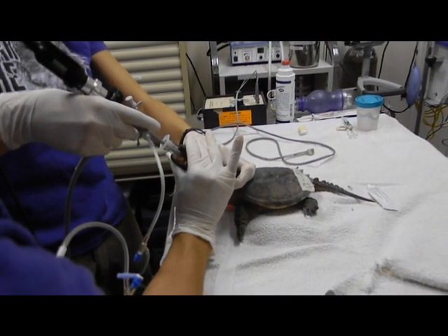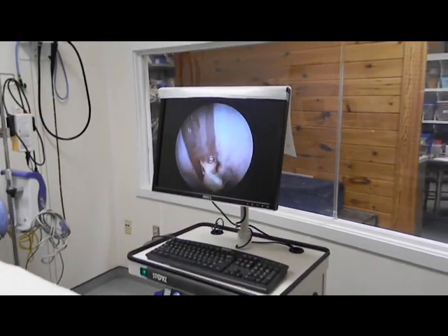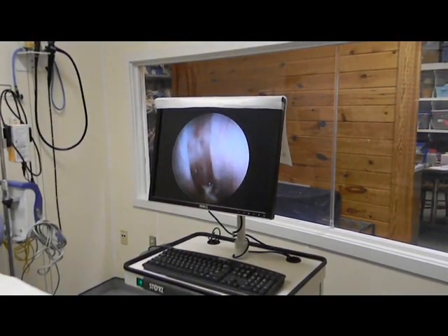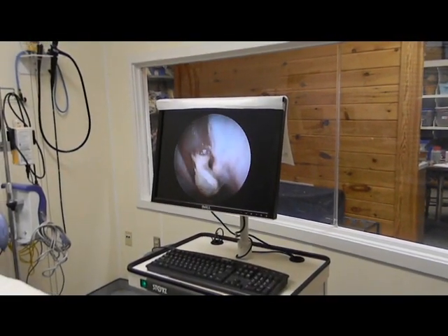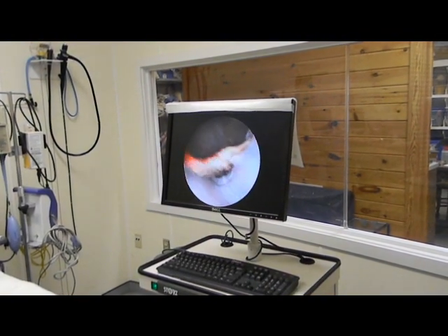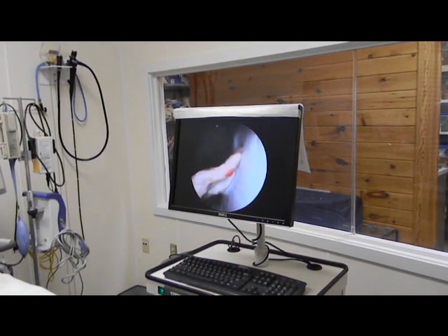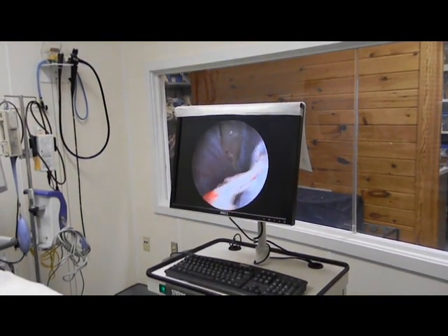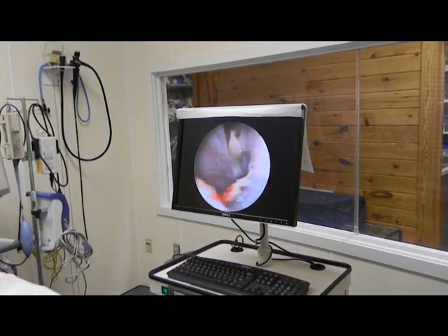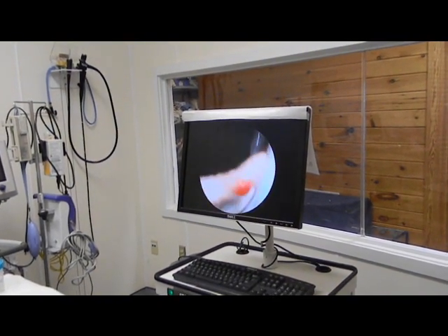So I want to try to — that just looks like mucusy stuff, but it seems like that's kind of big. But that also could be just depending on where, how he's sitting. Remember there is that abscess as well. So who knows if this thing — that may either be the little scab or that could be originating from right there. Let me see if I can push it.